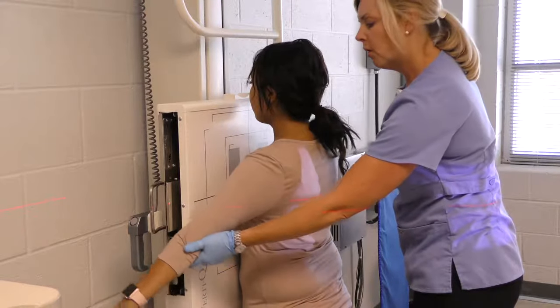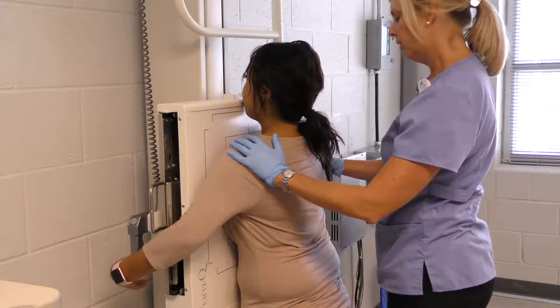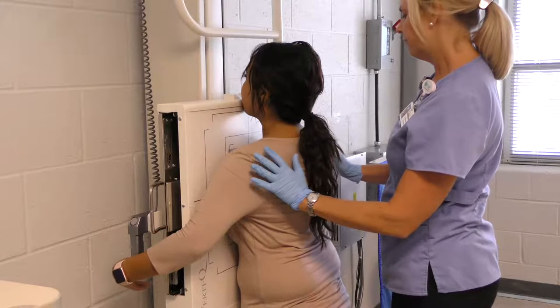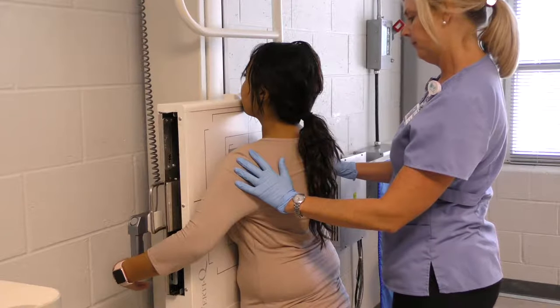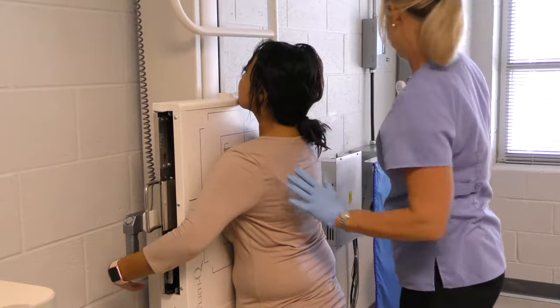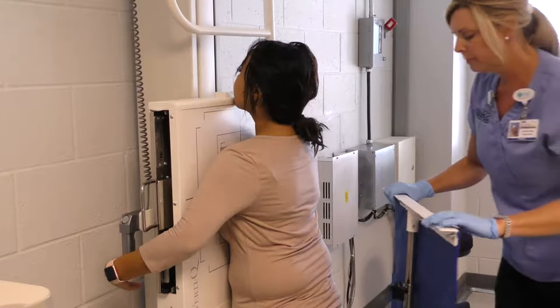Wrap your arms around the board. Roll your shoulders forward. Drop your shoulders — we want the scapula out of your lung field. Okay, and just lift your chin. We're going to place the shield behind you.